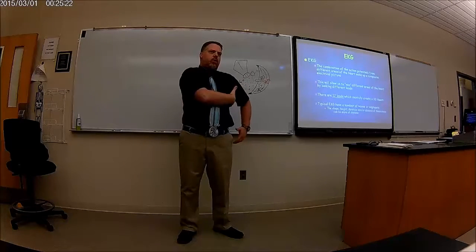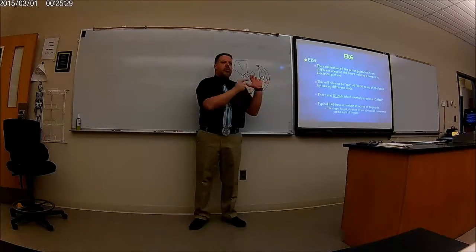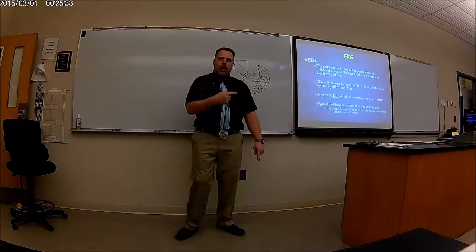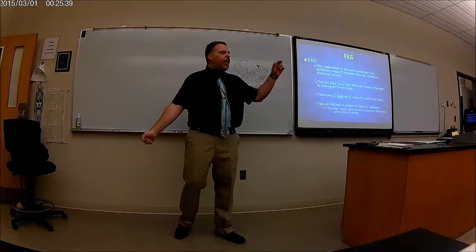Kind of goes right across here, and they have certain places to put them, all right? Then you're also going to have 3 other leads on the 2 wrists and usually on the ankle. There's other leads, and this is going all around the chest. The chest leads go right to the heart, so there's 6 right across there. But then how do you explain this?